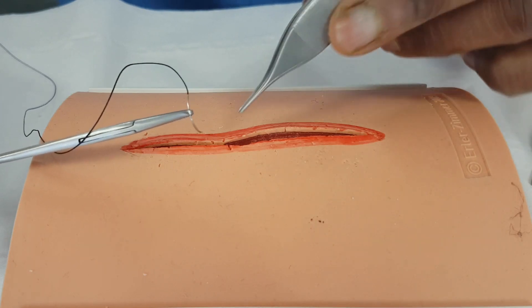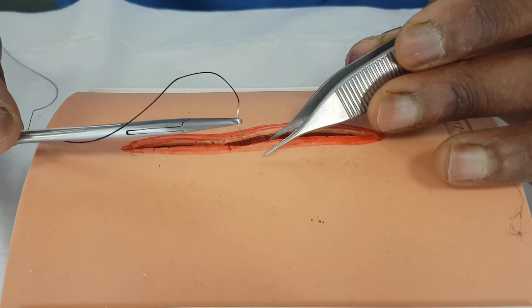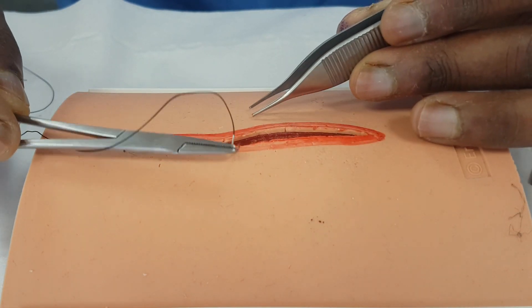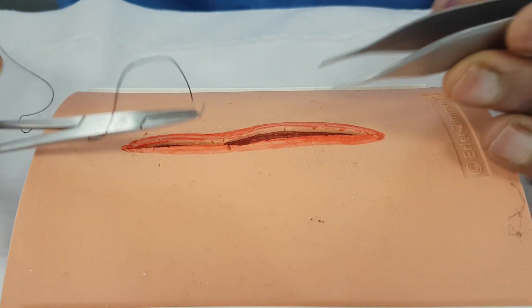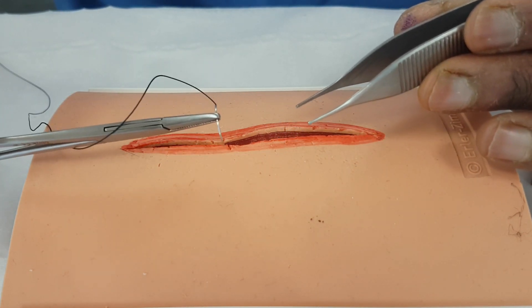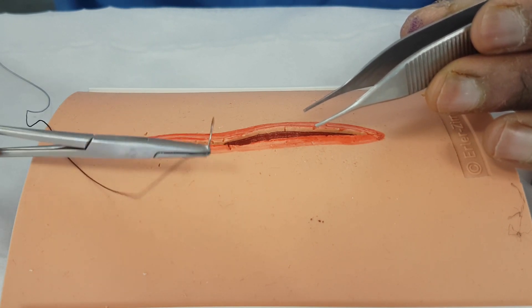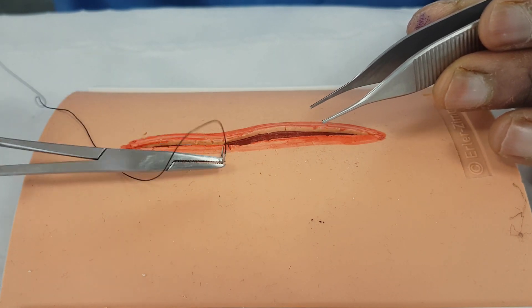The idea is that you get to the wound, you decide where you're going to start, and you want to look at the wound and try to get the full depth of the wound so it comes in as a curve. You don't want to close the top and leave the bottom part exposed, otherwise you'll have what's called a dead space, and that will increase your risk of infection. When you make your decision, you want to be able to use the curve of the needle — that's why it's designed that size — so the whole thing goes in one swoop.